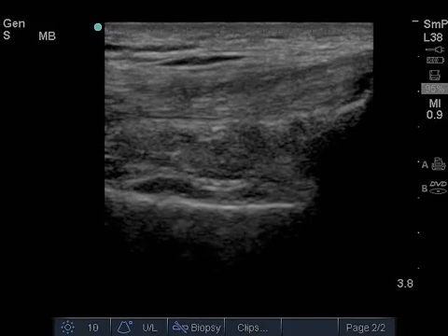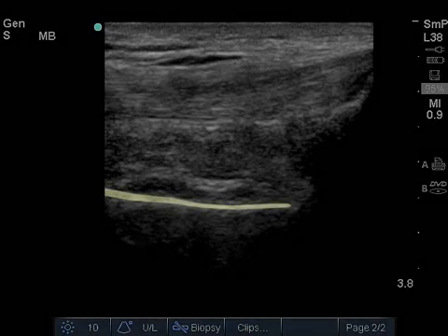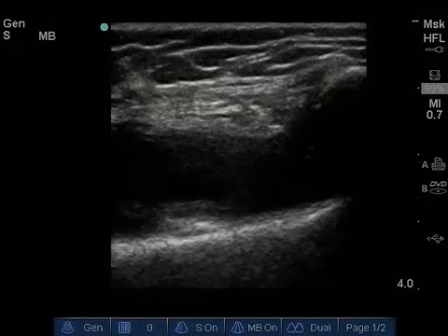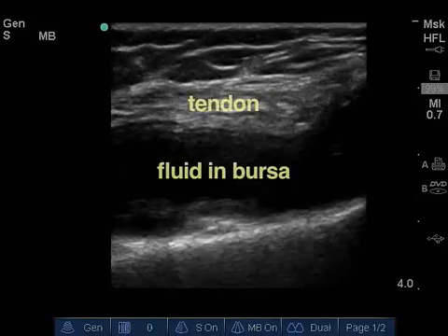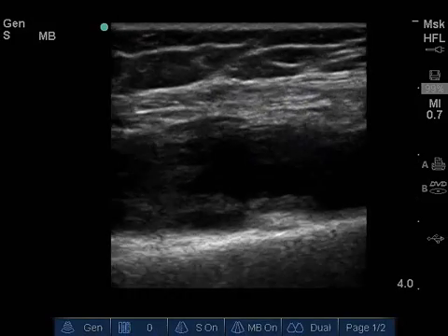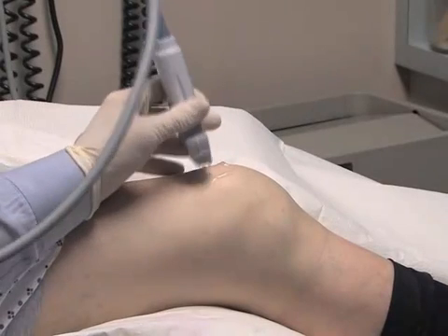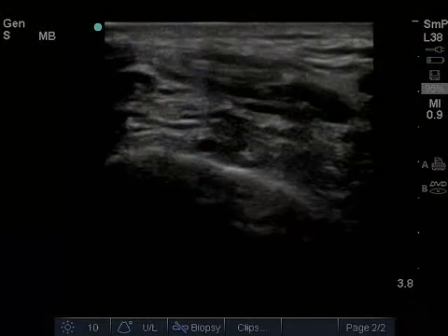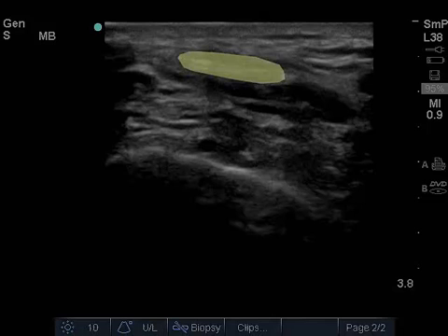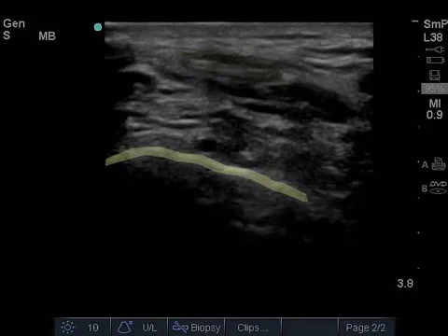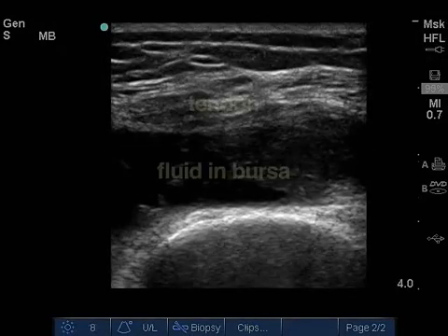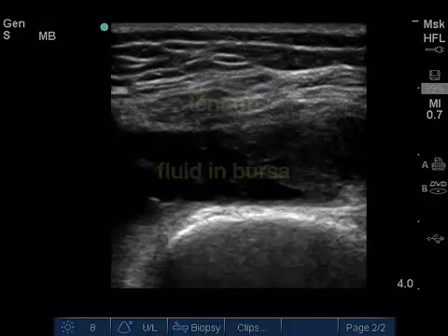The anterior cortex of the femur may be seen as an echogenic line deep to the patella. On the left side of the ultrasound screen, the moderately echogenic quadriceps tendon can be identified. Suprapatellar bursitis can be identified as a hypoechoic fluid collection lying deep to the quadriceps tendon. Next, place the probe transversely just superior to the patella with the directional indicator to the patient's right. The quadriceps tendon is seen in the near field and the suprapatellar bursa lies beneath it. The femur can be visualized in the far field as a curved echogenic line casting a shadow. If an effusion is present, it can be visualized deep to the quadriceps tendon as an anechoic signal.